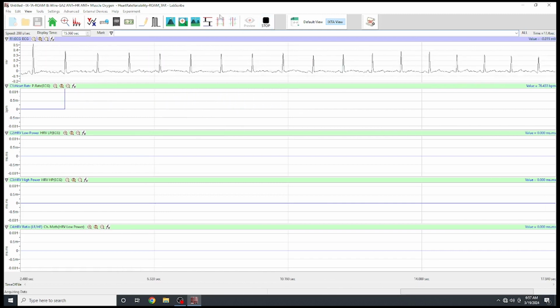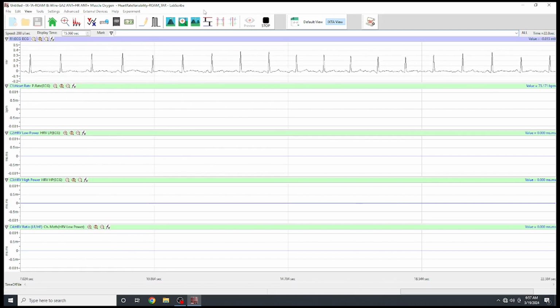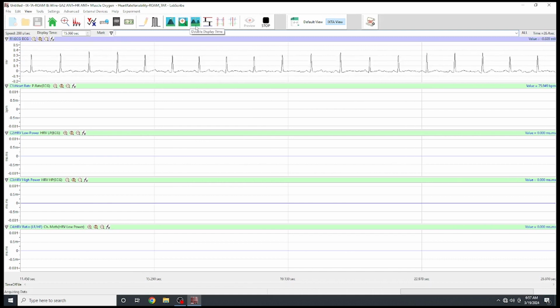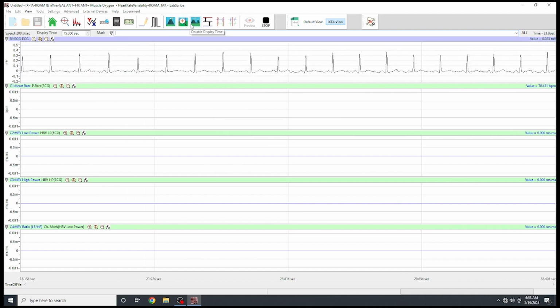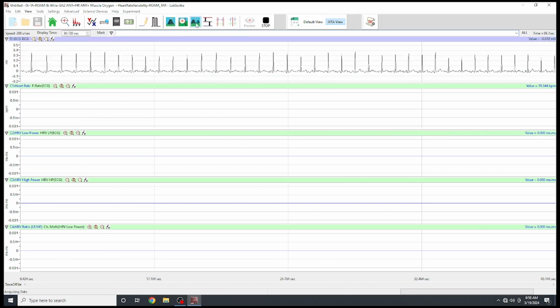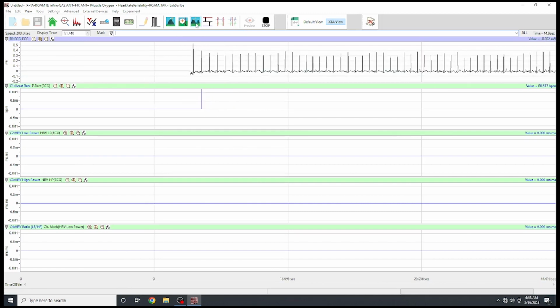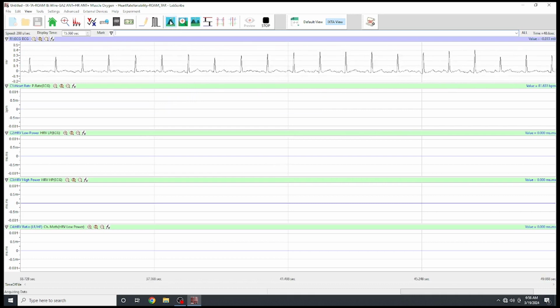Now, while the screen is recording data, you can zoom in and zoom out on your data. You'll notice on the top of the screen there are two buttons, one with what looks like two mountains, one with what looks like one mountain. That increases or makes bigger and makes smaller the display. If we hit the two mountains, we'll notice we start seeing more of the live data, or the data has been previously recorded. And with the one mountain button, that will zoom in.